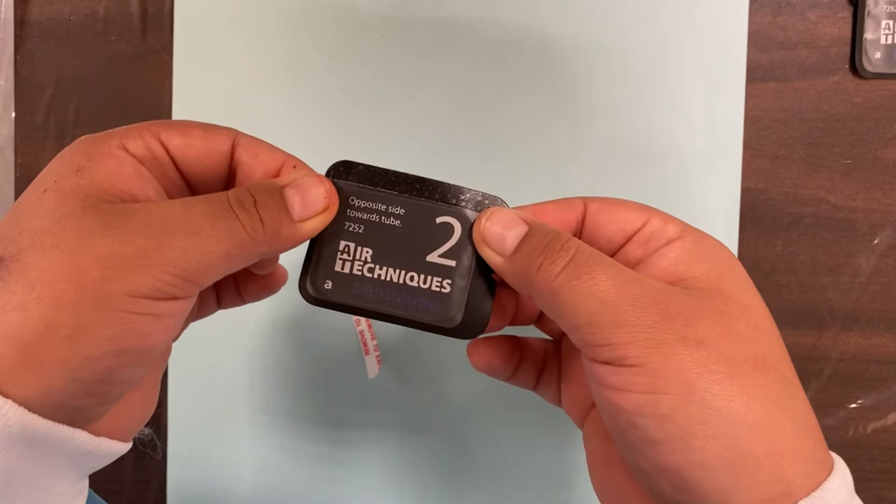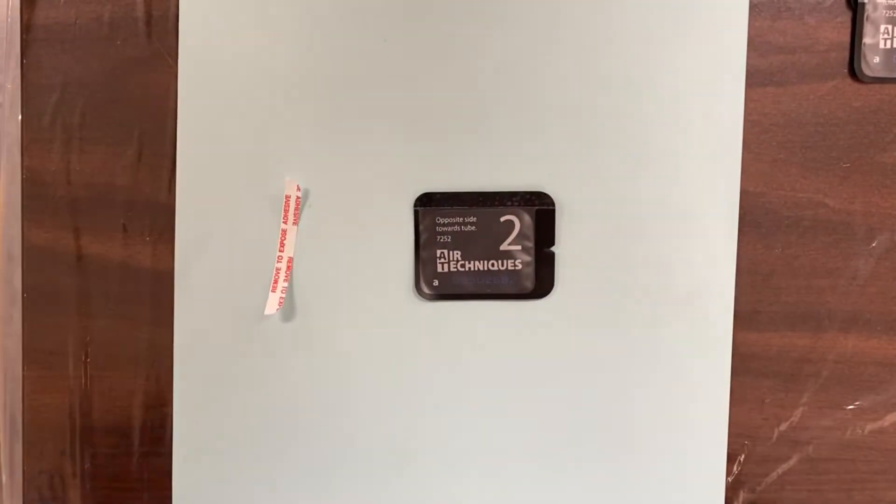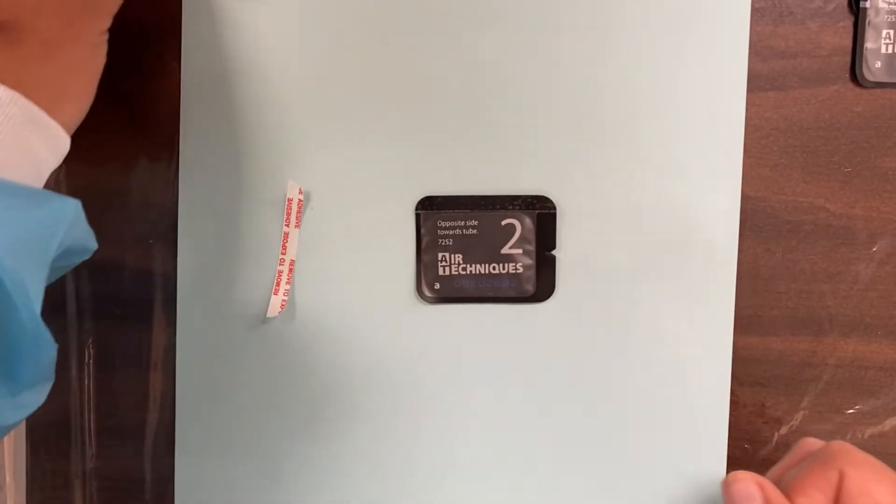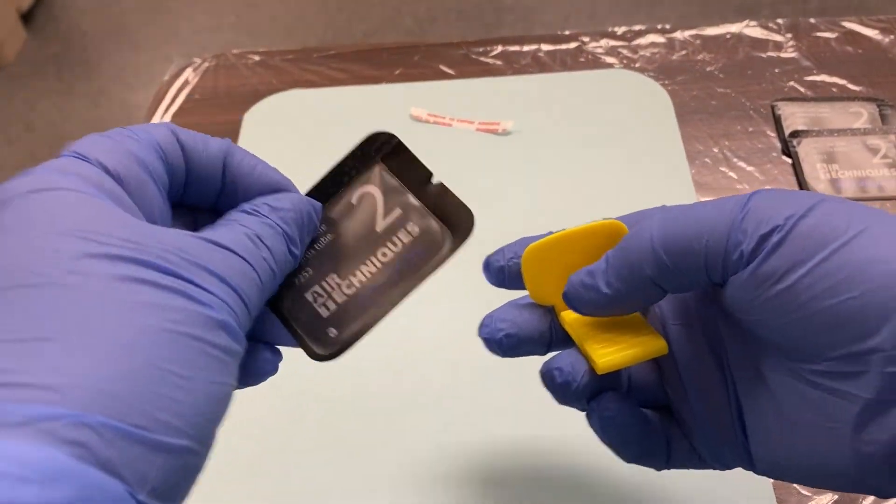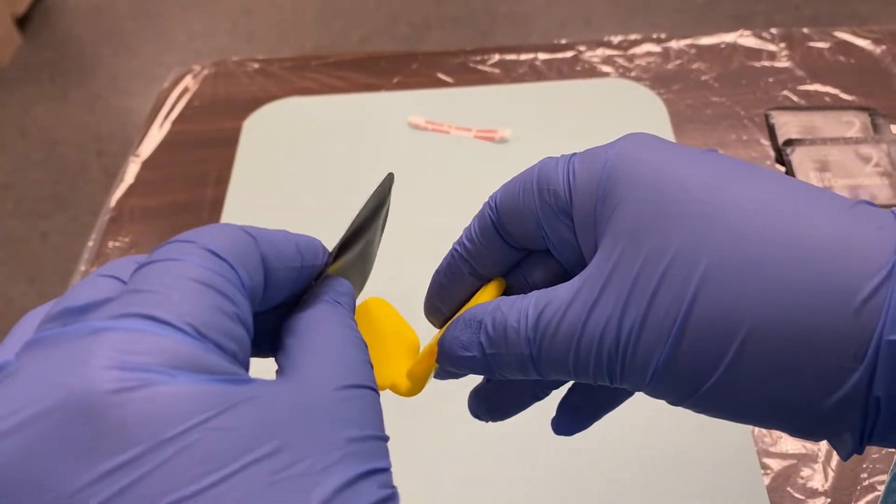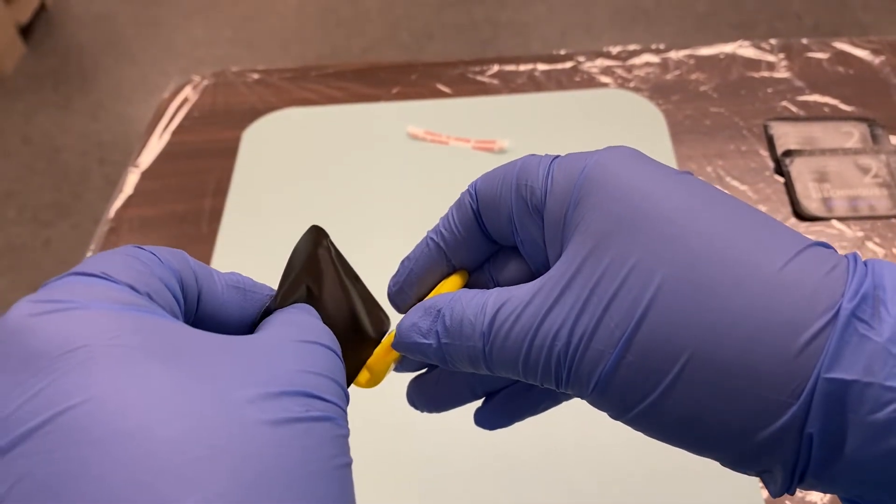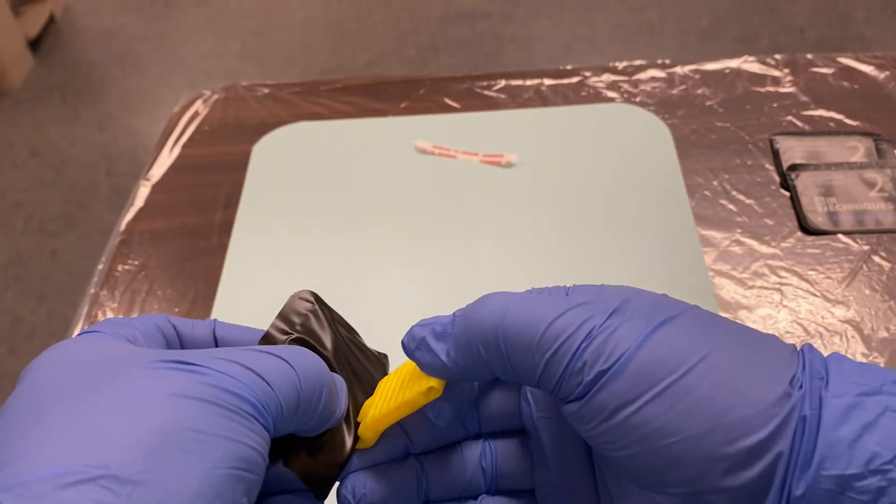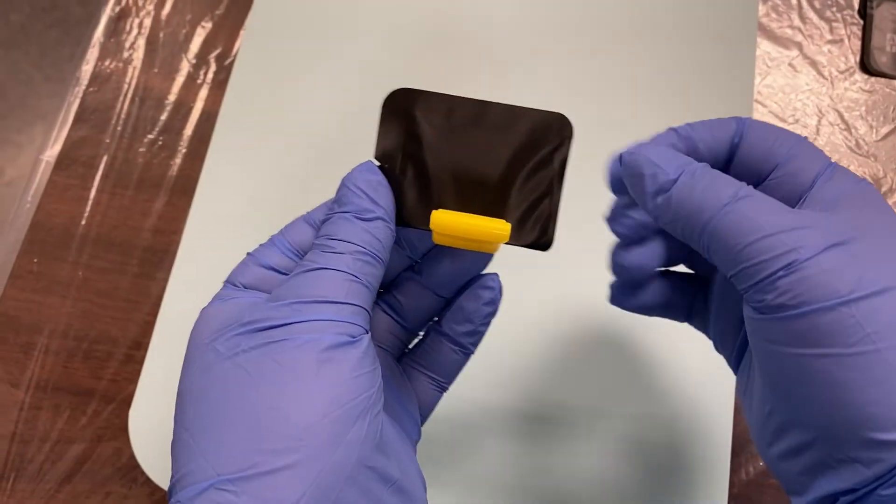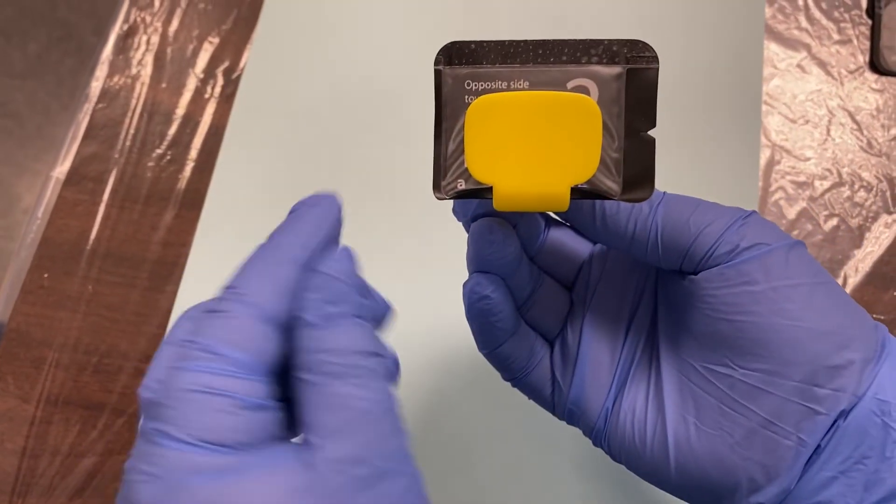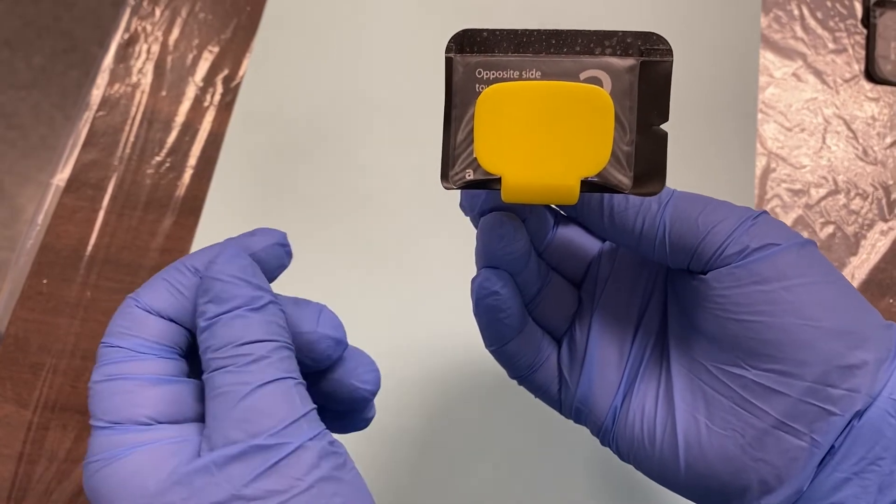Also, like this, we're going to be able to read that it says opposite side towards tube and that'll help us upon the placement of the bite block here. So we want to make sure that the block side is facing outwards just like so and we want to place it nice and tidy right in the center and make sure that the A is on the lower left side since we're taking a PA here.